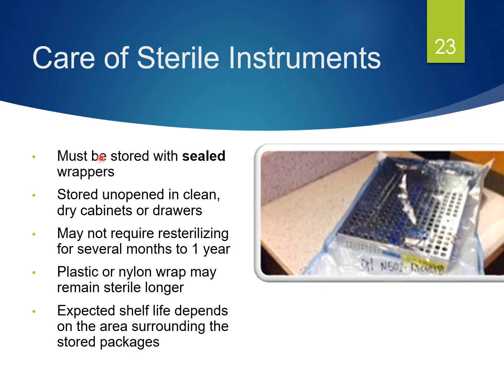Re-sterilization may not be required for several months or even up to a year, depending on the environment, as long as they're in a dry environment. Plastic or nylon wrap may keep them sterile even longer. Again, it depends on the area where it's stored and the shelf life. All stored packages are usually dated, rotated, and handled very carefully to prevent tearing.